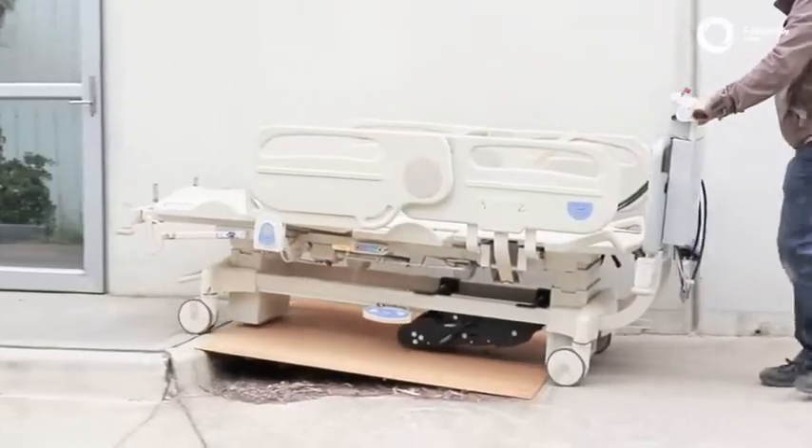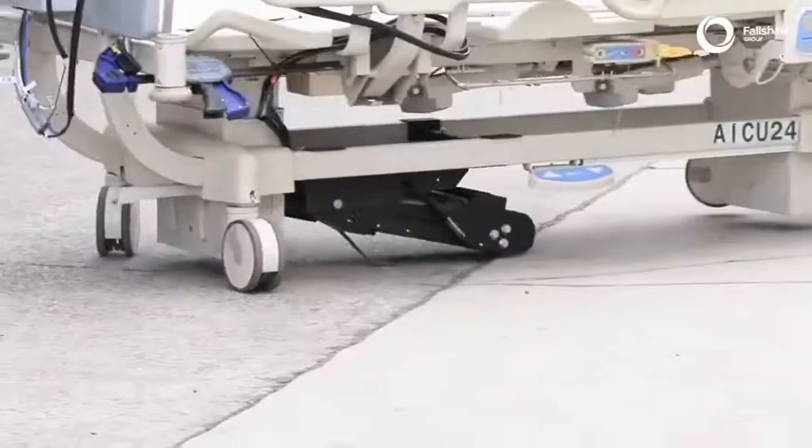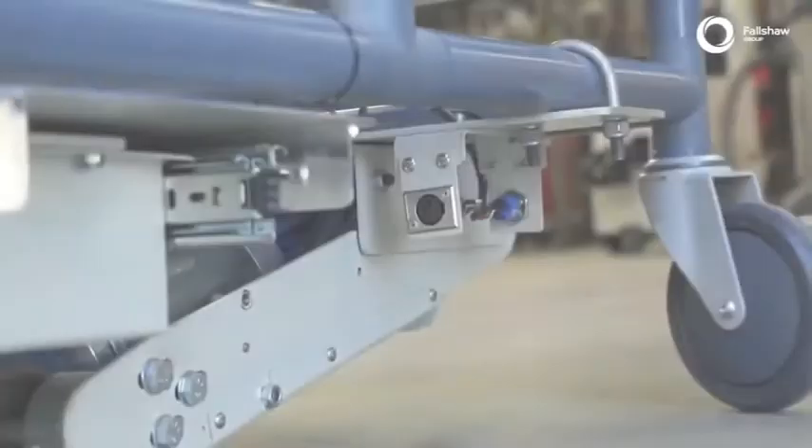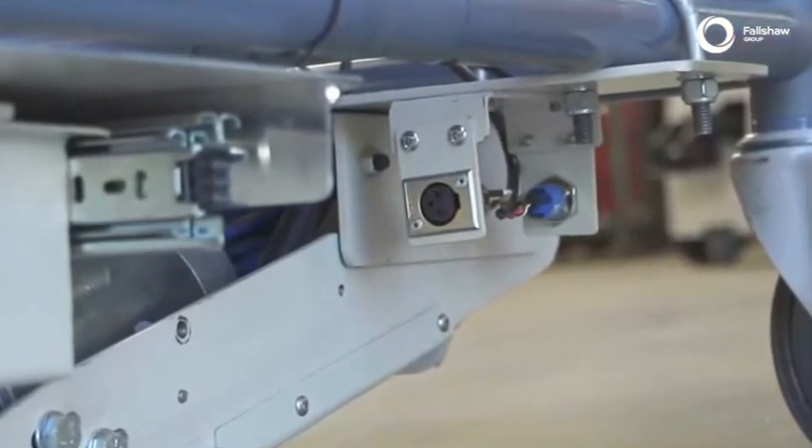It is very easy to manoeuvre, reverse, or pivot. A charger socket is included and can be mounted anywhere on your trolley or hospital bed.